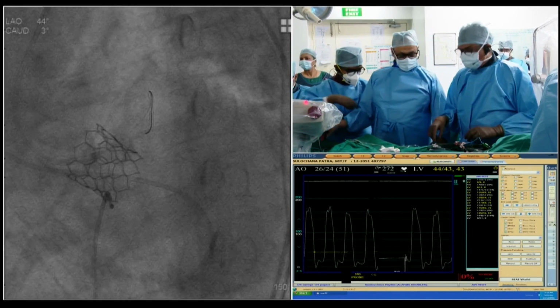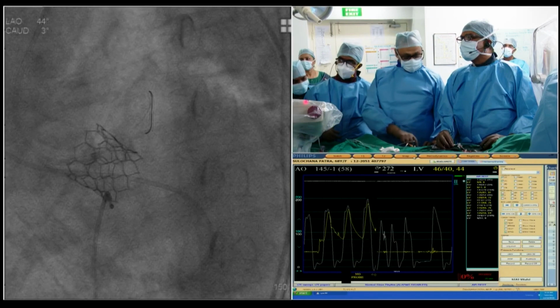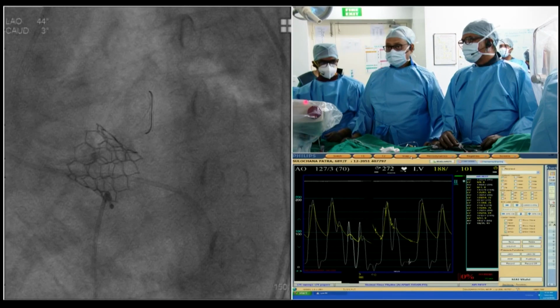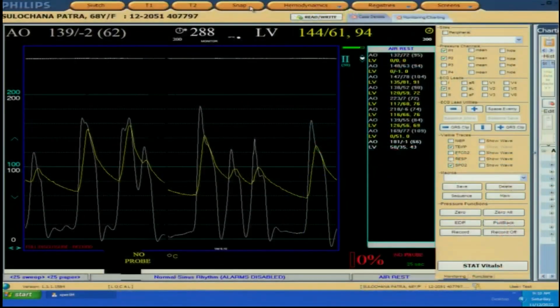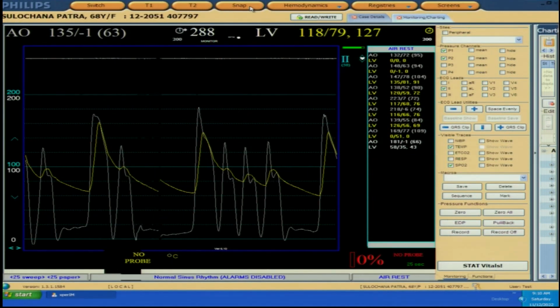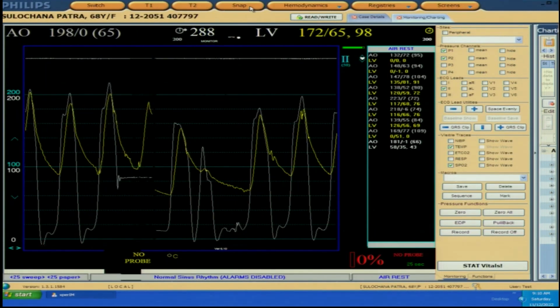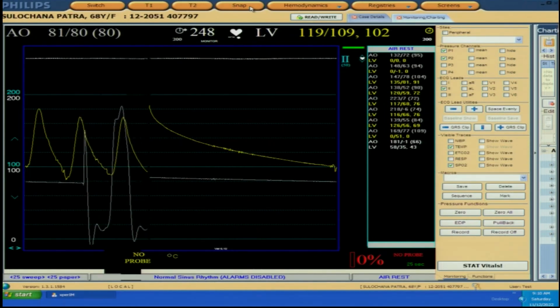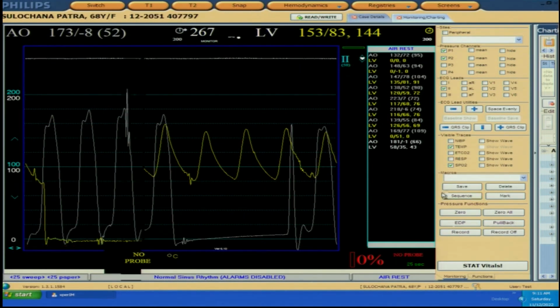Do I have two hemodynamics? Where's the other one? Yeah, it's there. You can see the pressure. Anil, can you see the hemodynamics on your screen? Maybe you need to zero both the transducers. But we still can't see the EKG. I'm going to flush you. Oh, you can't see the EKG. Let's zero both at one time. Yeah, both zero.